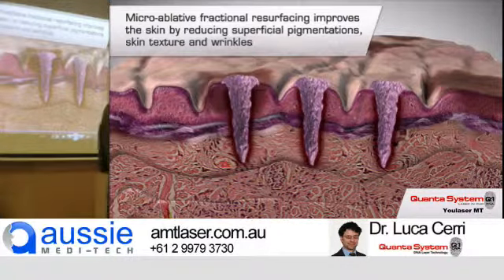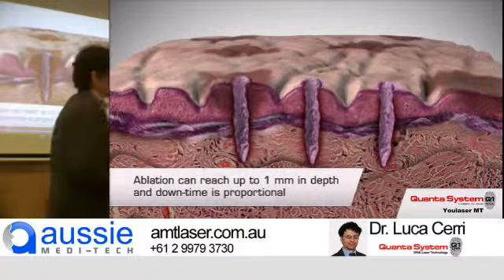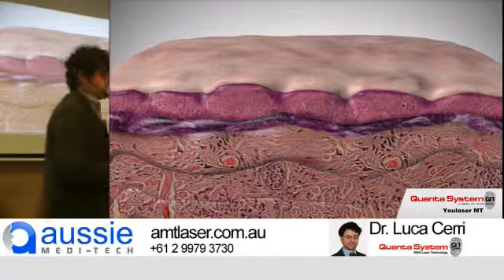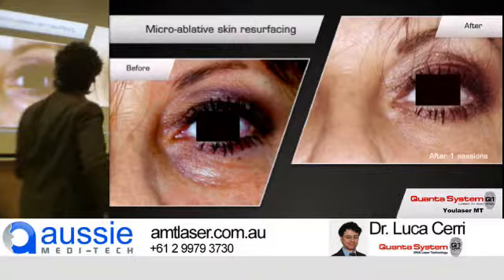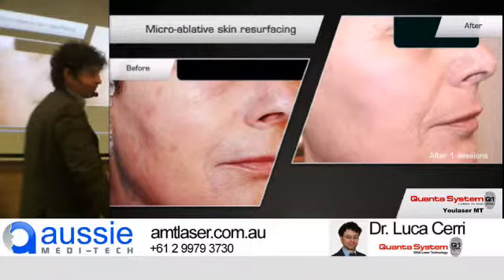But if we stay just in the epidermis, we can have a very homogeneous color with very short downtime, because we are superficial. High density, very superficial, the CO2 alone can be used, and this makes sense. In all the other cases, combination.